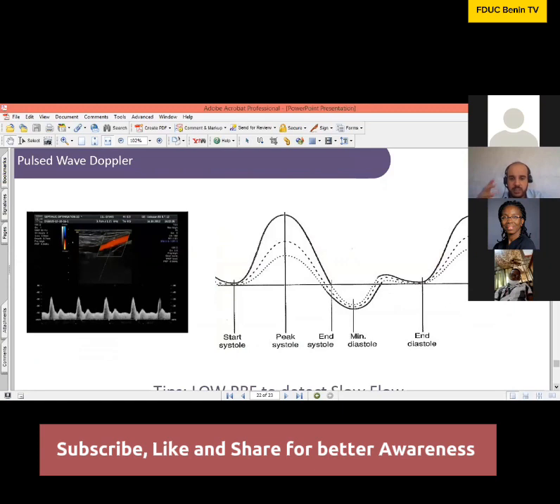And once we have put our sample at the middle of the vessel, if you want to detect low flow and have a good sensitivity of your spectrum of the pulsed wave Doppler, we should always use a low PRF to detect slow flow.